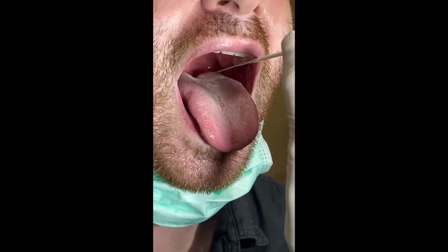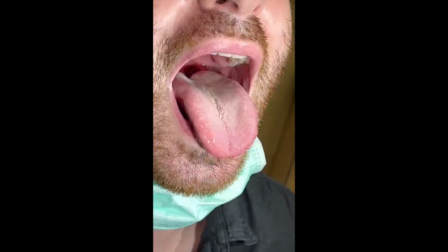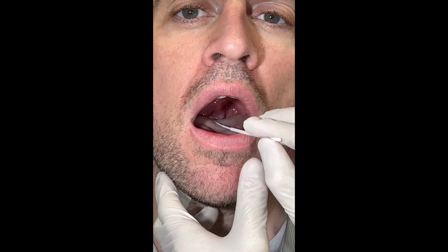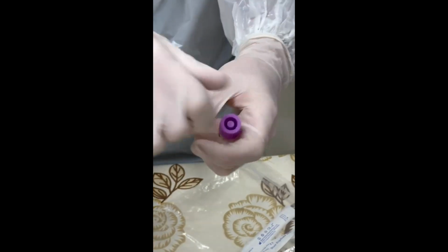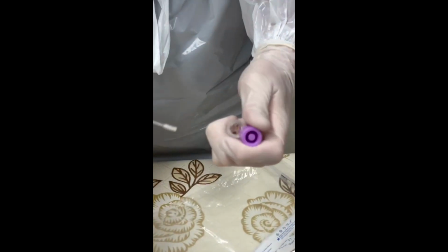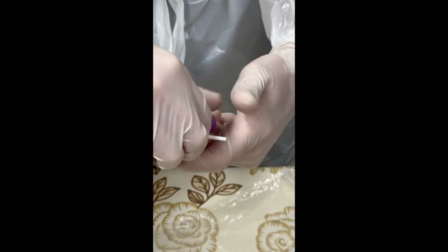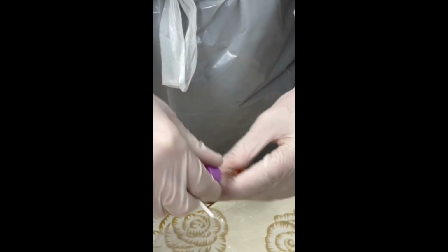Rotate the swab between your thumb and forefinger back and forth in a complete rotation 4 times. This should take approximately 4 seconds, 1 second per rotation. Afterwards, put the soft tip of the swab into the tube first, snap the swab at the breakable neck, and screw the cap of the collection tube firmly closed.